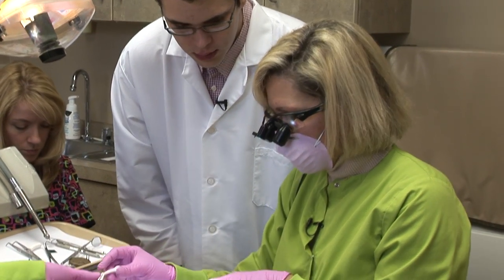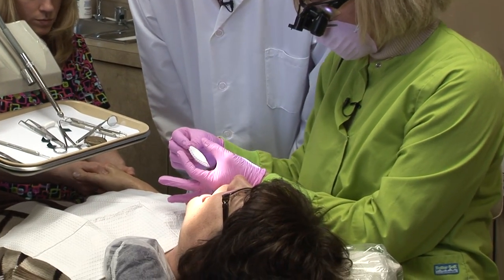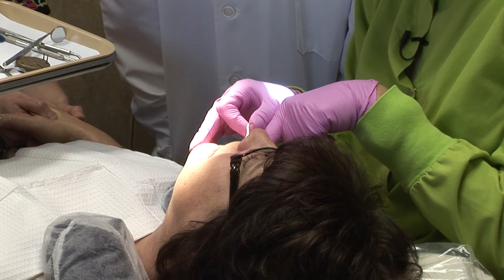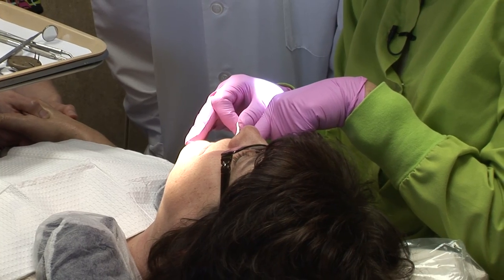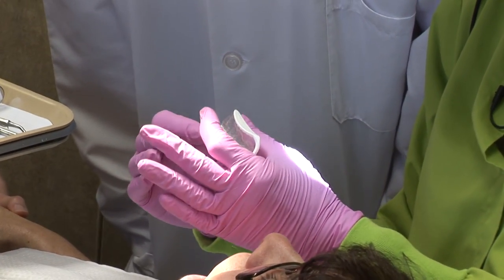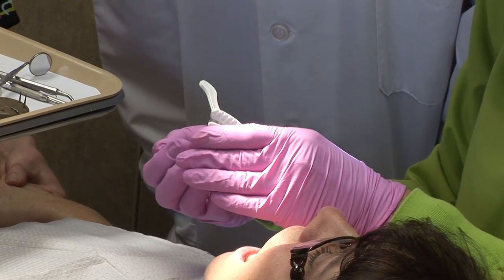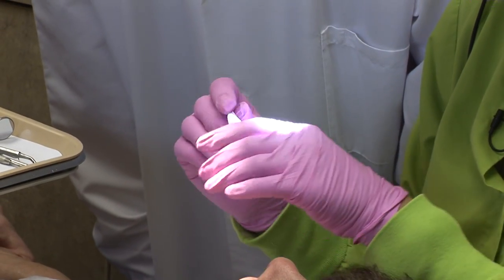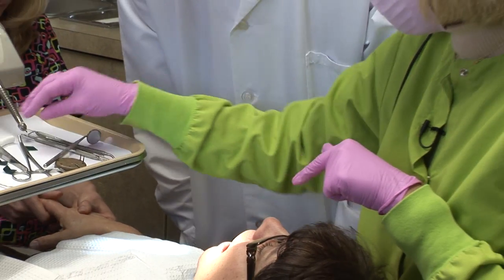She's going to bite into this tray — it's going to have goo on both sides. Bite together. She's going to bite just like that, and when we open it, it'll have an impression or mold of both sides of those teeth. They're going to then pour plaster into both sides of those to make replicas of the teeth, and they'll be able to make a crown from that. And I'll show you a final product of that.